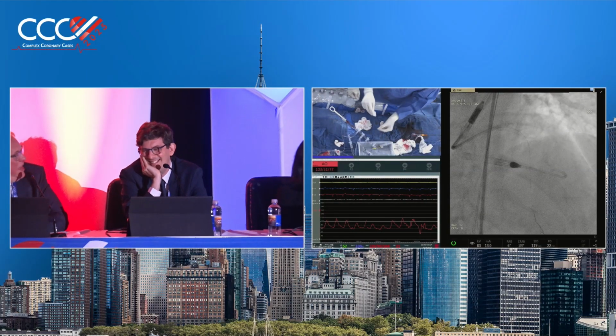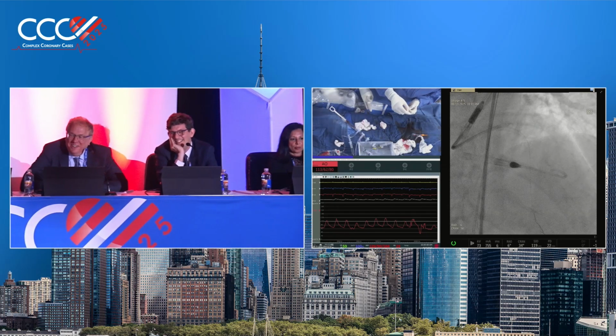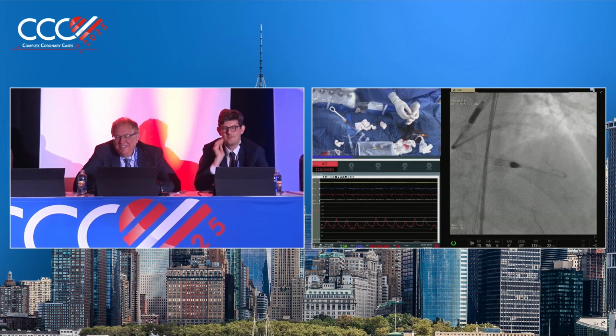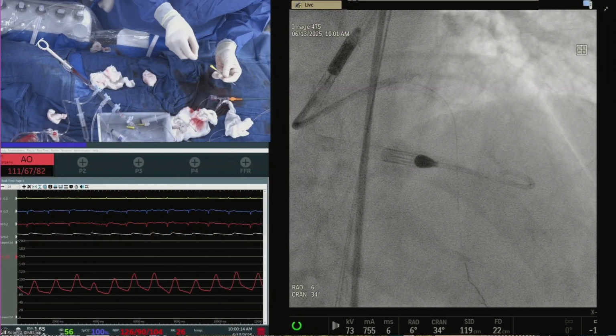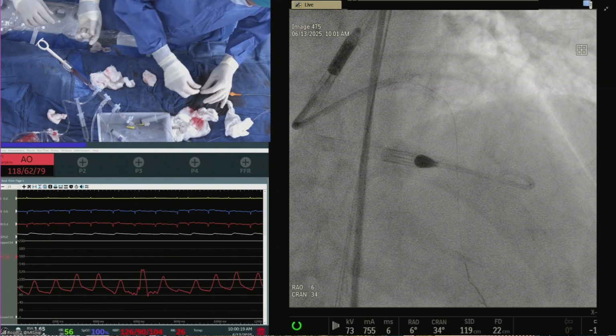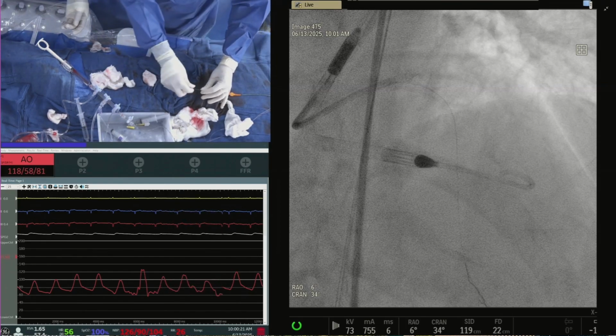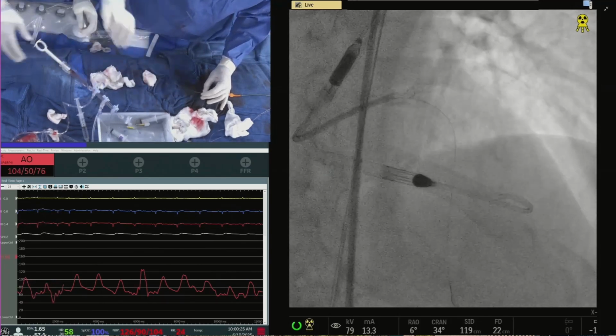But if you do that, you better do it without imaging. Because if you image this, there's no way you're going to do anything but stent it. Yeah. Bruno? Okay, but it's a 2.5 balloon, so we'll do it. The diagonal we've never dilated. You have to do lesion prep. You have to dilate all these things. Yeah, that's what she's going to do, drug-coated balloon, but luminal gain is still the most important thing. We got that.